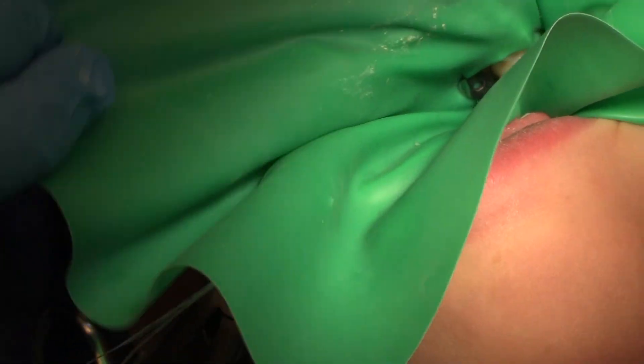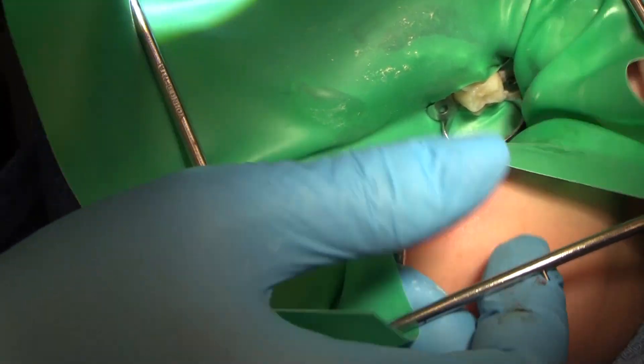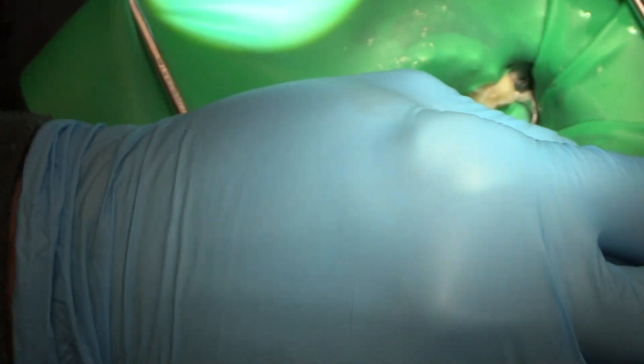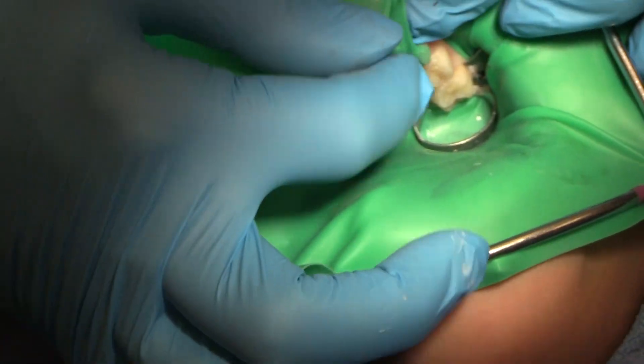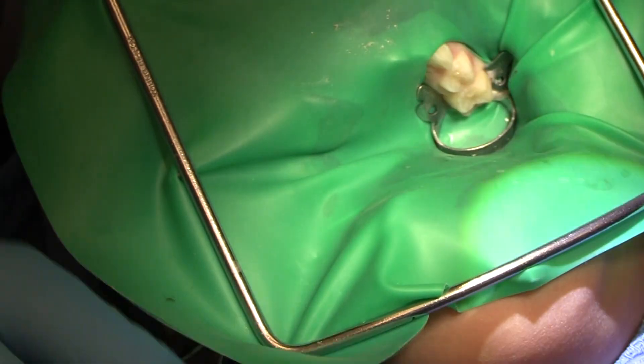Clamp size is super important, especially if you're planning on using any kind of matrix system, because the matrix rings will be buttoned up against your rubber dam clamp if you're trying to matrix on the same tooth that you're clamped on — which is exactly what we're doing in this case.